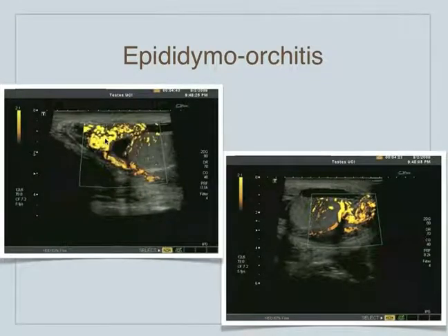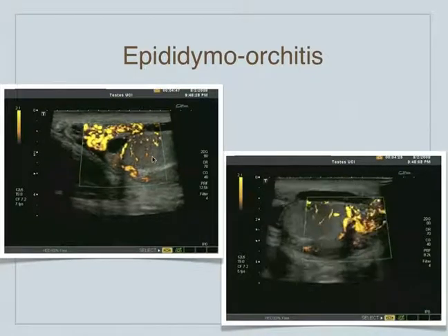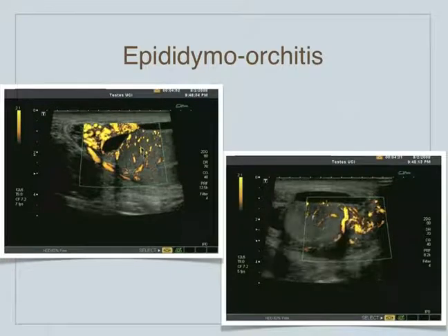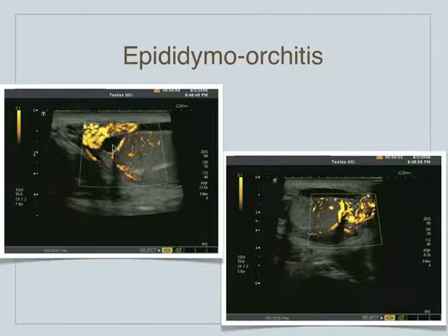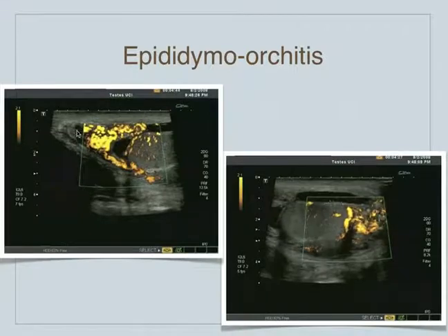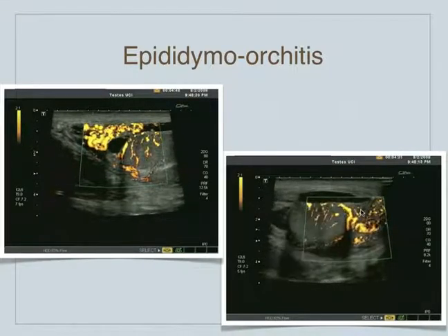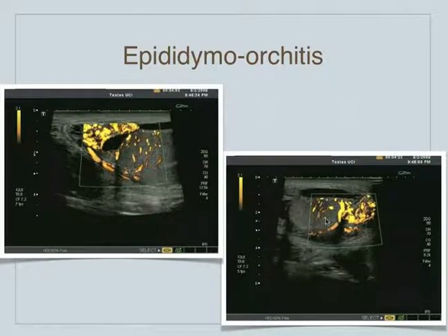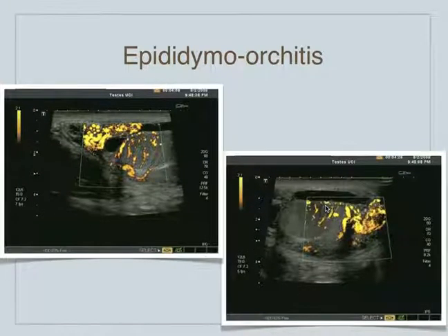This is epididymo-orchitis. We can see both the epididymis here as well as the orchitis component. This is the head of the epididymis, very enlarged, and the testicle has also got a lot of flow to it. This black area is an epididymal cyst, which is very common to see in the epididymis. The spermatic cord is up here. In the sagittal view, we can see the tail of the epididymis is very hypervascular, as well as the testicle — both hypervascular, consistent with epididymal orchitis.